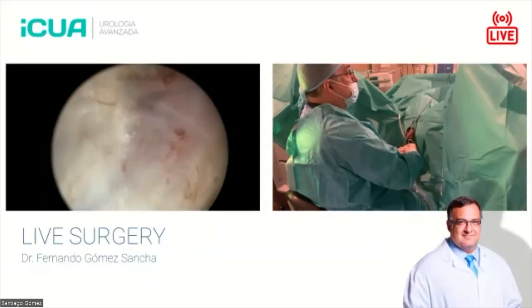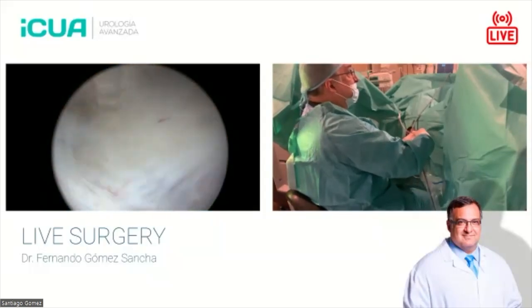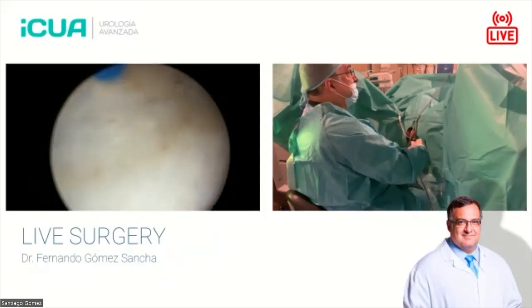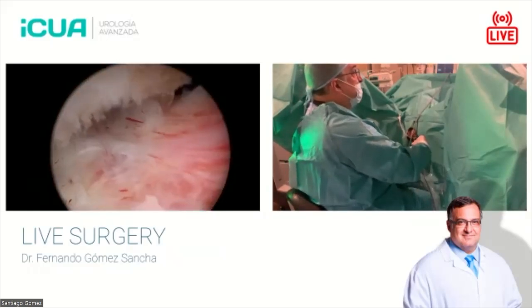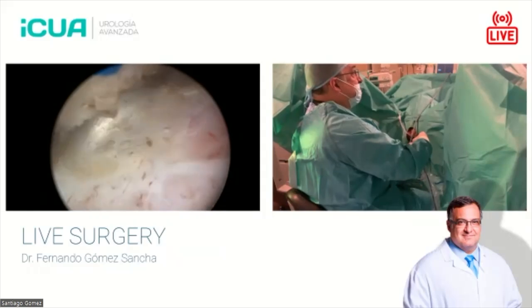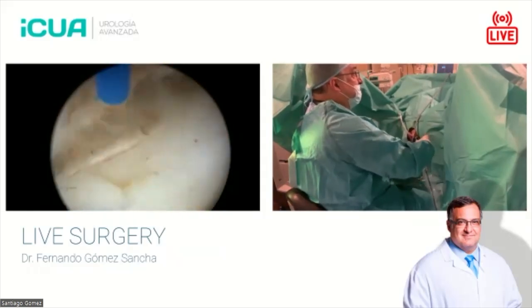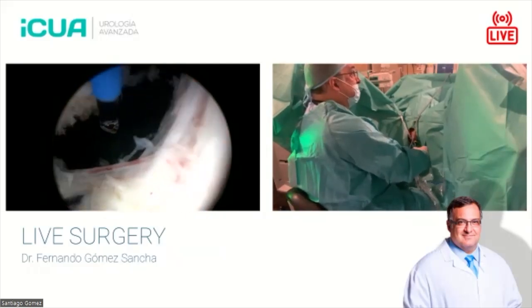And the procedure is nearly finished now. We just have to continue dissecting the posterior aspect here. Let's see if we can see the bladder there. You see, this is the bladder. We had the UO very close, so we will be careful there. I will go in again to check the position of the UO before I cut this, if I can.